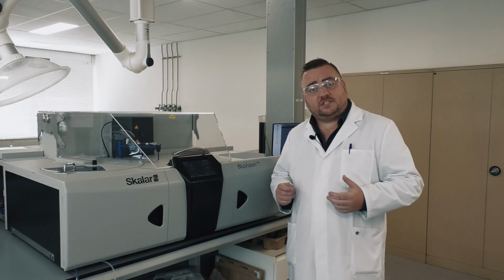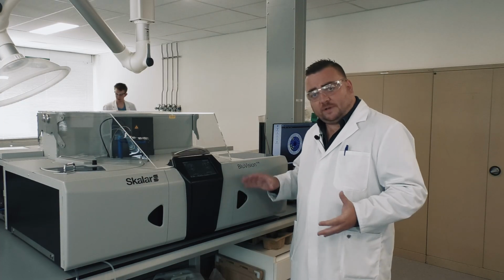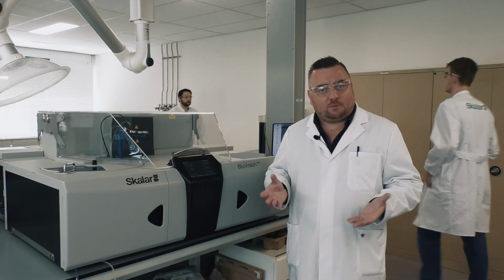And just a last mention of the overpressure and exhaust system I mentioned earlier. That functionality is also active in this section of the analyzer as well, to prevent the re-entry of any waste fumes from entering the reaction zone of the analyzer.